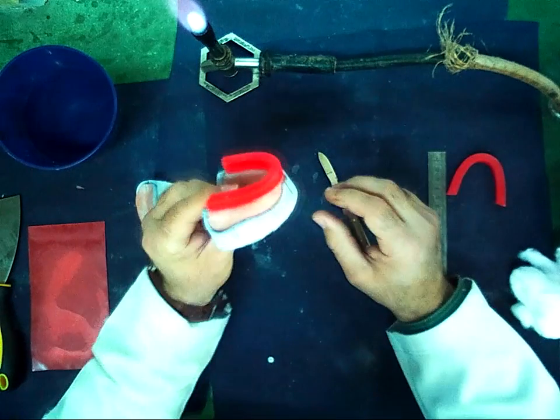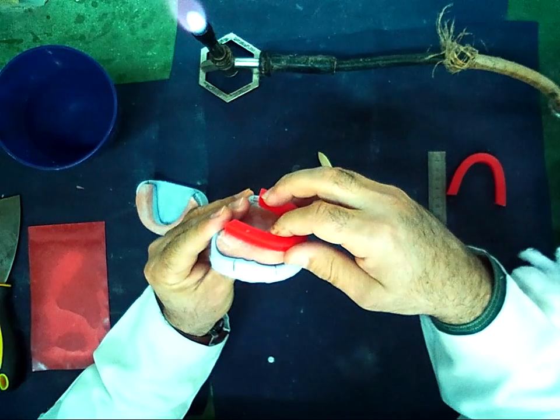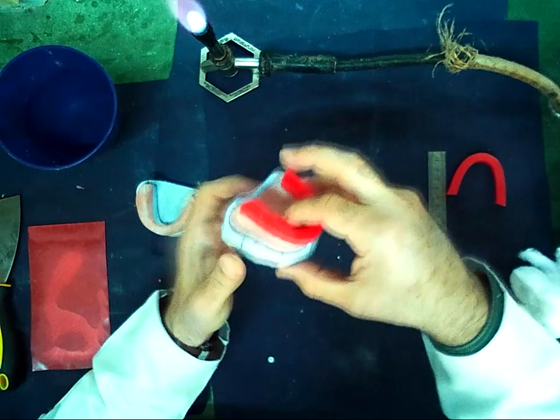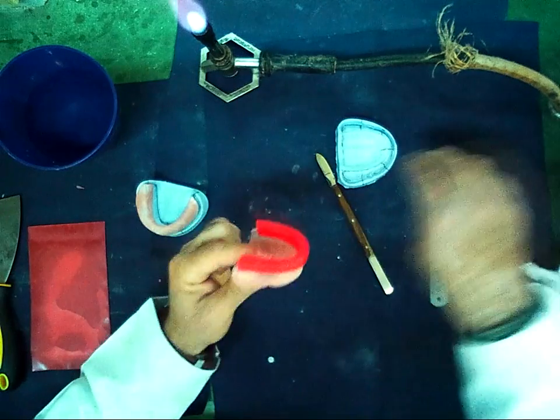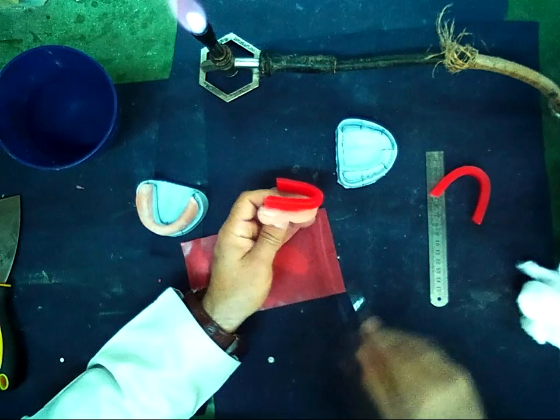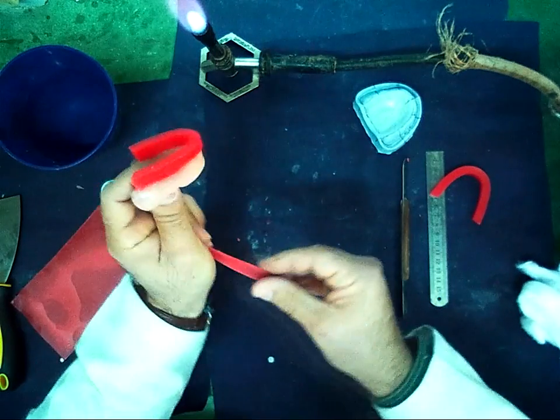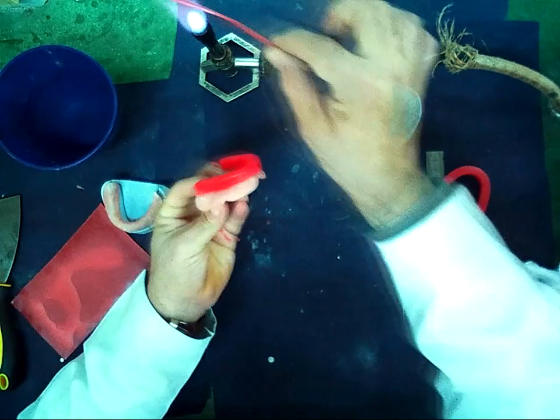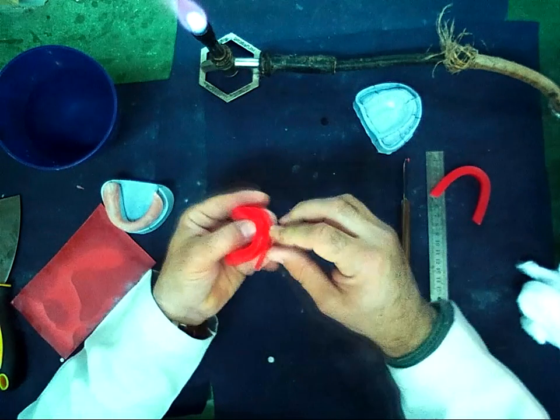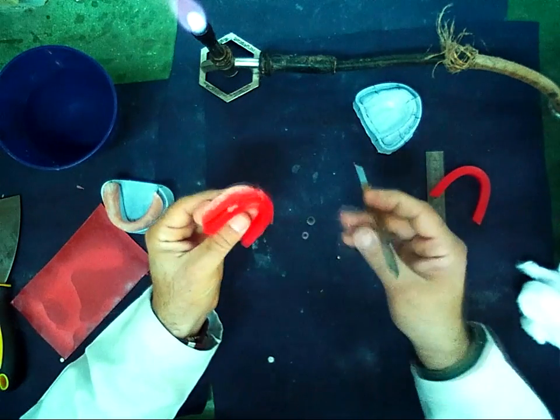Now I should make the final position of the wax. I should fill this space by using the sheet wax, cutting it in small pieces and melting it on the flame, and fill these spaces. And after that, I should make my measurement.